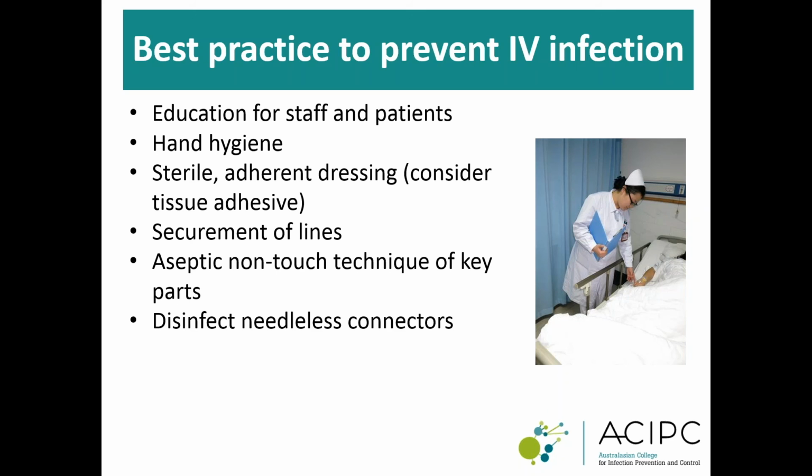Clearly, hand hygiene, as we discussed, a sterile adherent dressing, securement of lines to prevent micromotion of cannula, aseptic non-touch technique of key parts when administering fluids or medications, and disinfecting needleless connectors. These are all important strategies.